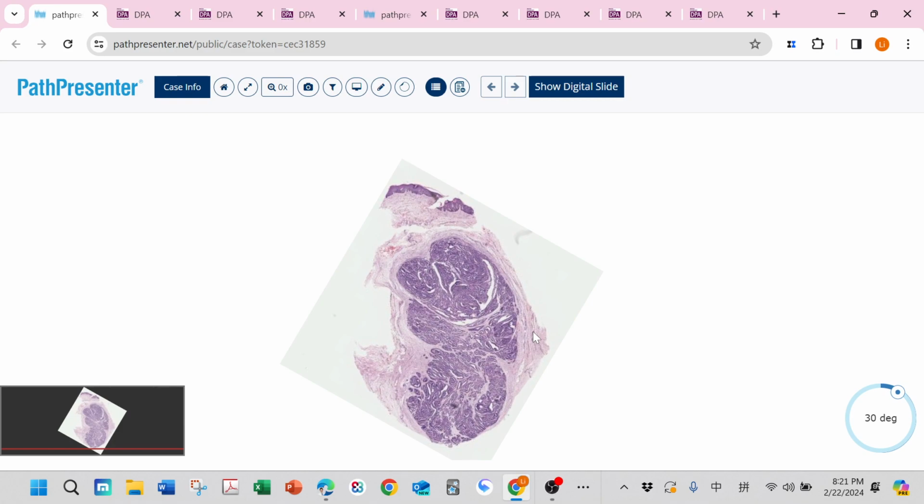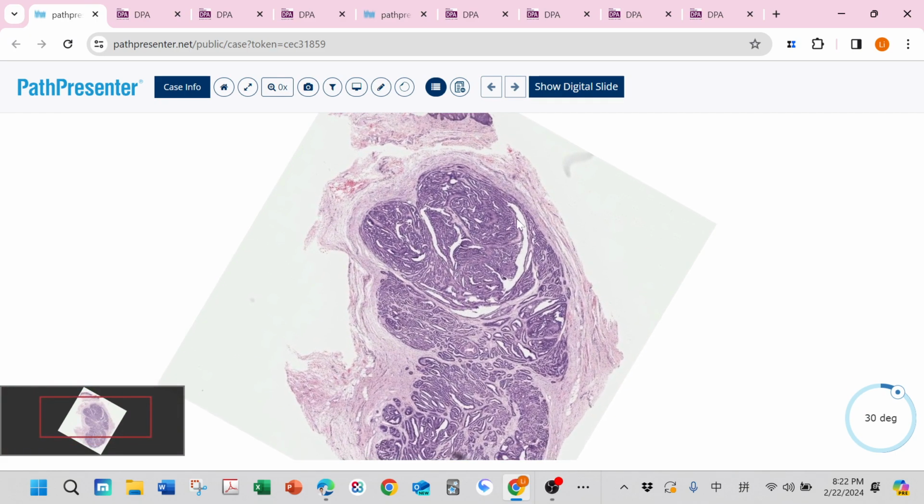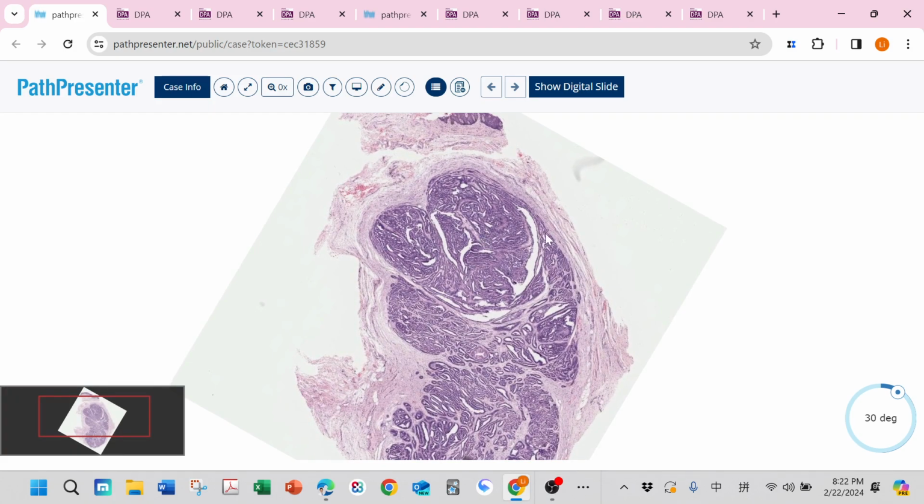This one is called Hidradenoma Papilliferum. Actually, this lesion is usually small, less than 1 centimeter, and the usual location is in the genital area, especially in the vulva. It's just a nodule, a well-demarcated nodule in the dermis. Even in low power, you can see this maze-like structure. If you walk into this maze, you will never find a way to go out.